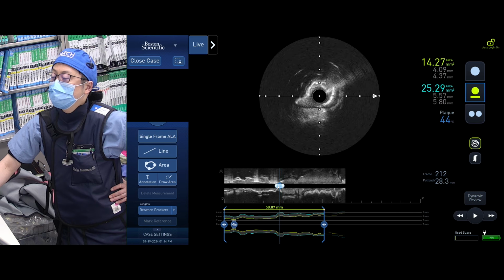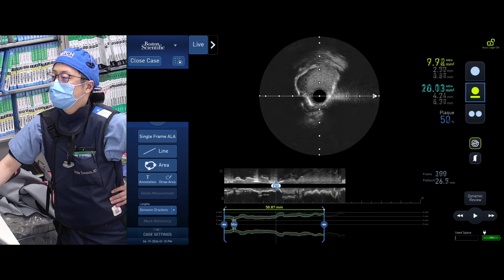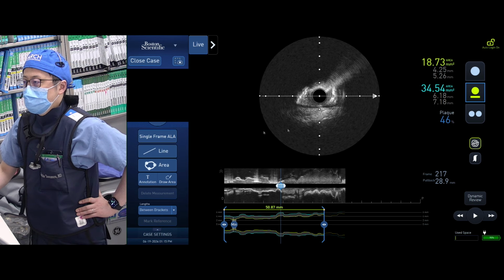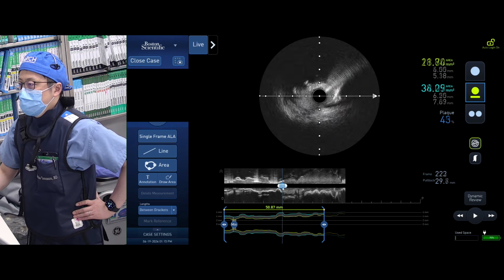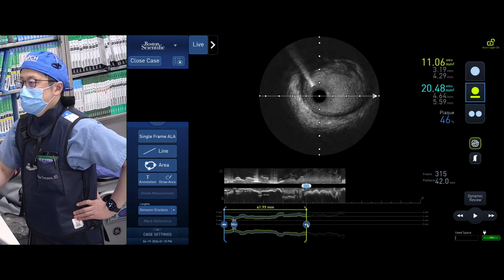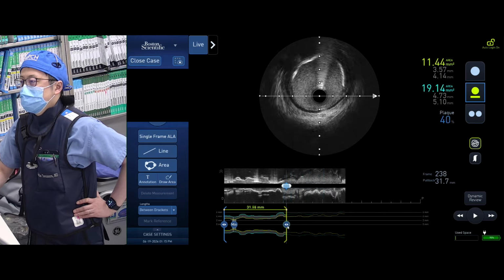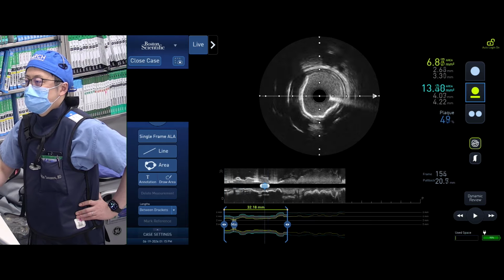Yeah. And also substantial calcium behind the proximal and the distal. It's not a thrombus, it's a calcified nodule. Yeah, and it is a healed calcified nodule rather than looking like an eruptive nodule. So that's the difference. So, I mean, this is calcium treatment 101 right here. You have to understand what kind of calcium you have, and if you can image pre, it is more beneficial than anything you do. So this is great, guys. I think understanding the type of calcium and how we treat the calcium is very, very important, really.